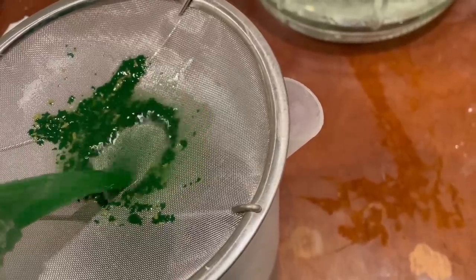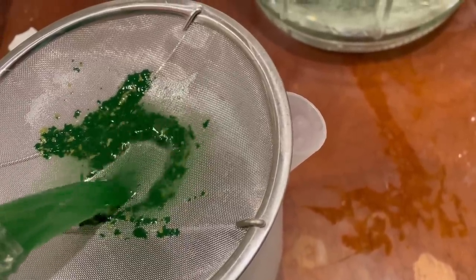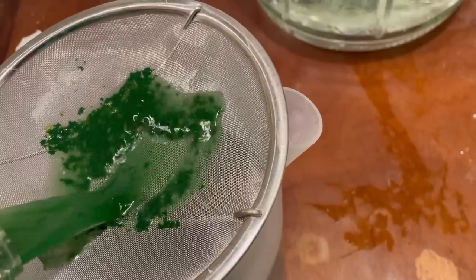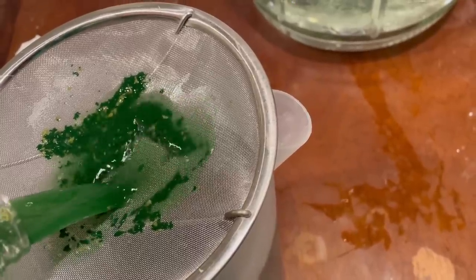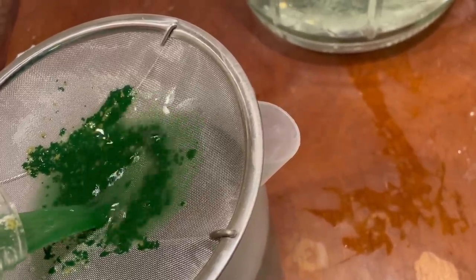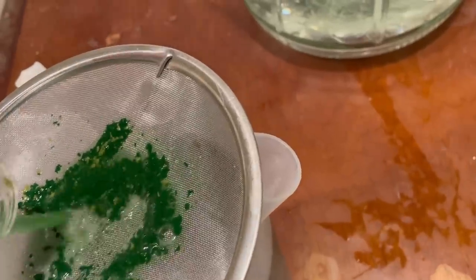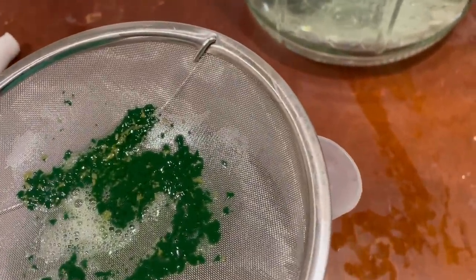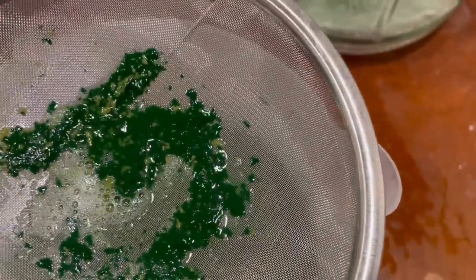I'm sieving the algae again to get rid of clumps and dead algae. The dead algae is more likely to get caught by the screen because the spiral form of the algae gets tangled up, and without being alive to untangle themselves, it remains in a clumpy form.